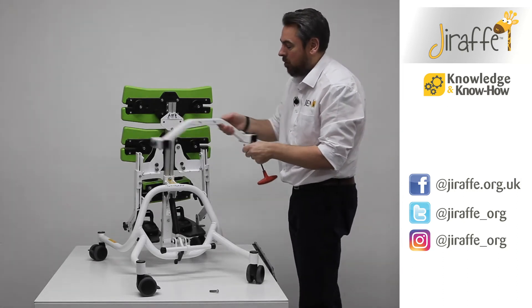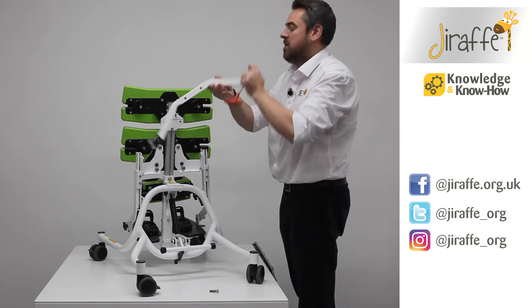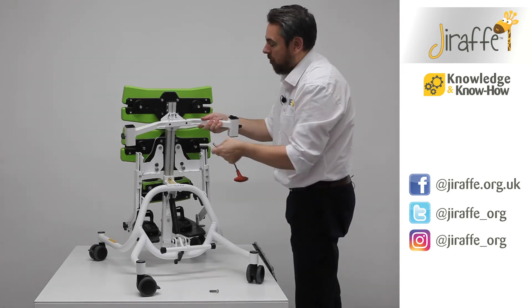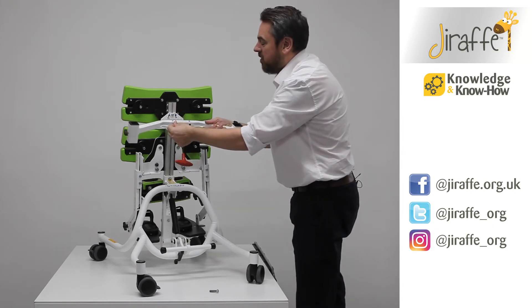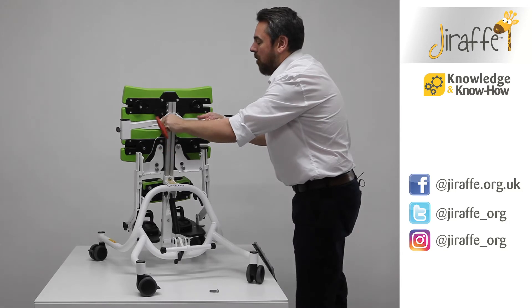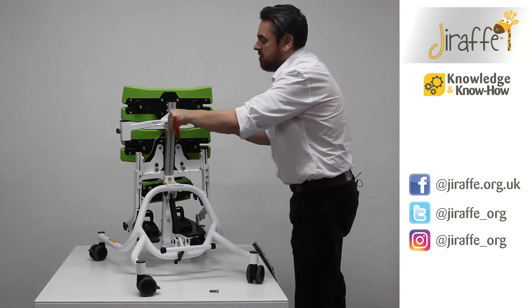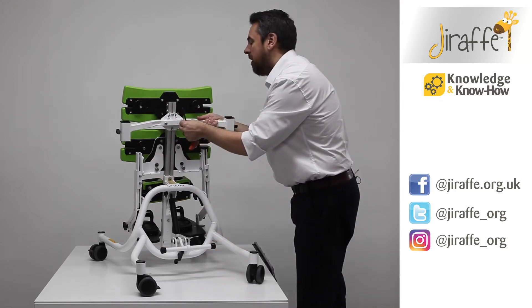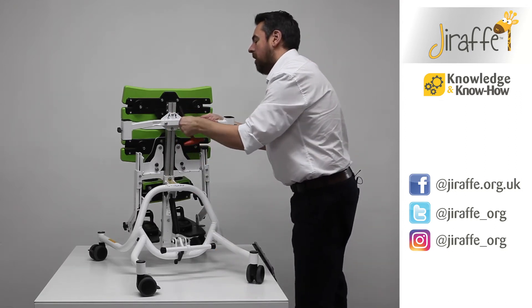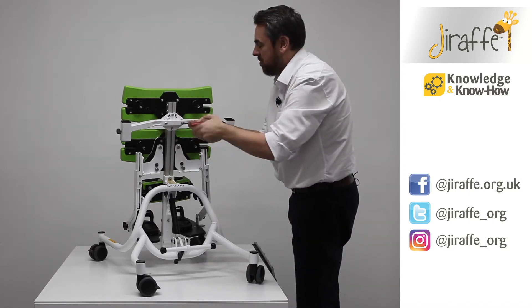Remove that bolt completely. For supine we were in this orientation, so now for prone we're going to swap round — our stickers will line up and illustrate that we've achieved the prone aspect. Then simply put the bolts back in to fix into place, put the second one in, release the brackets, and make sure these are done up tightly.